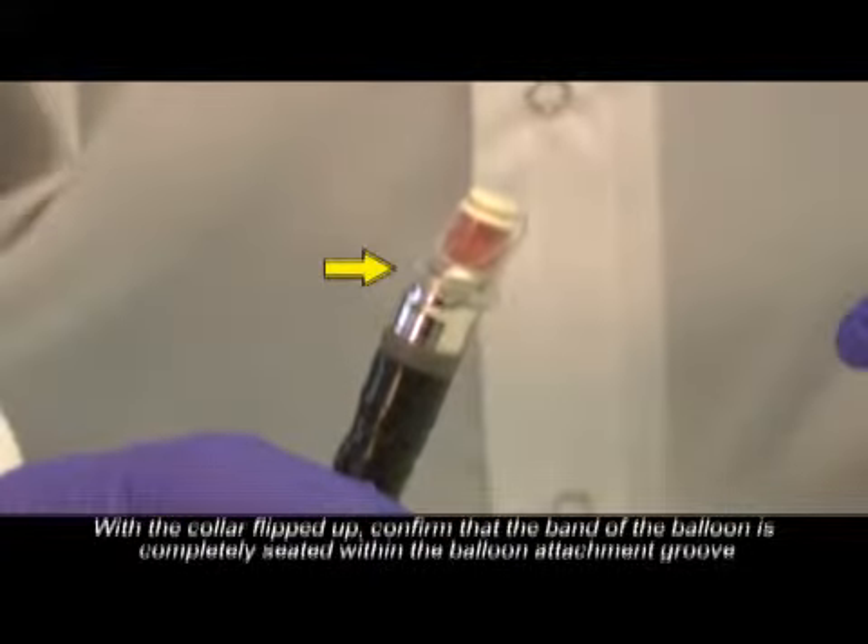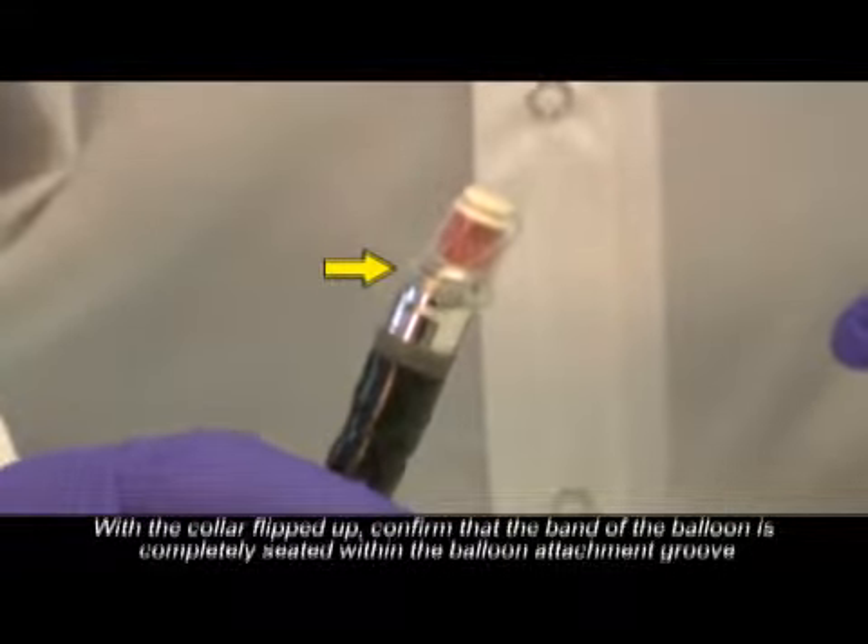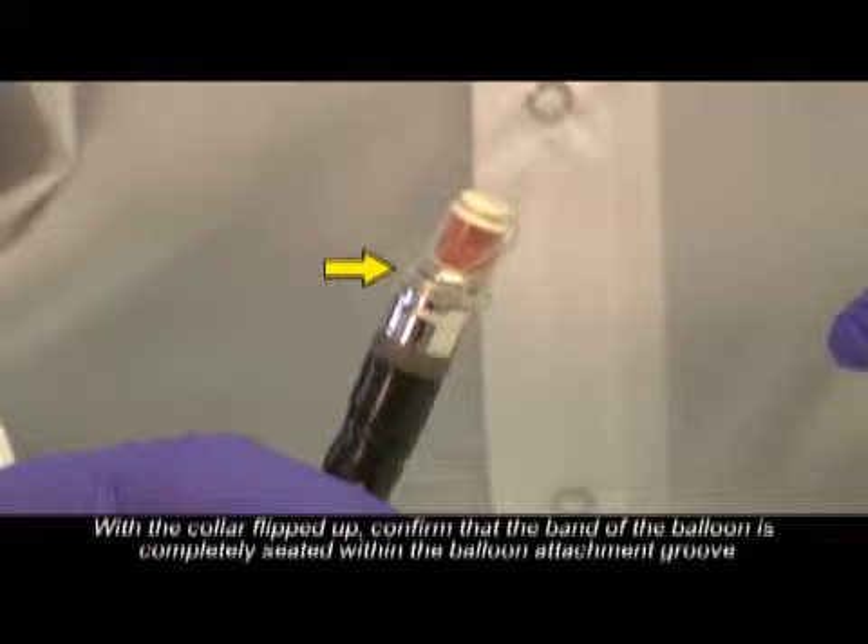With the collar flipped up, confirm that the band of the balloon is completely seated within the balloon attachment groove.